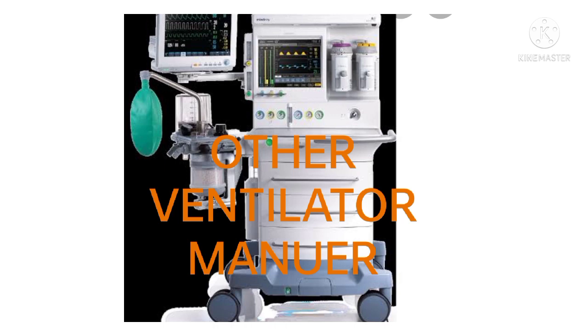Continuous positive airway pressure, CPAP, increases FRC and is similar to PEEP. However, the pressure of CPAP is delivered continuously during spontaneous breathing, thus preventing the patient's airway pressure from falling to zero. For example, if CPAP is 5 cm H2O, airway pressure during expiration is 5 cm H2O. During inspiration, 1 to 2 cm H2O of negative pressure is generated, thus reducing airway pressure to 3 to 4 cm H2O. CPAP is commonly used in the treatment of obstructive sleep apnea.